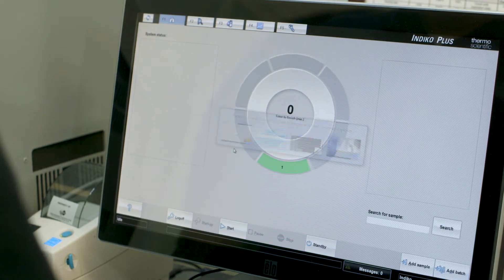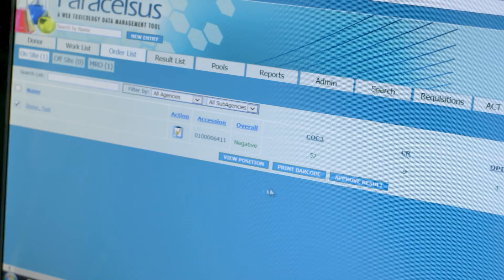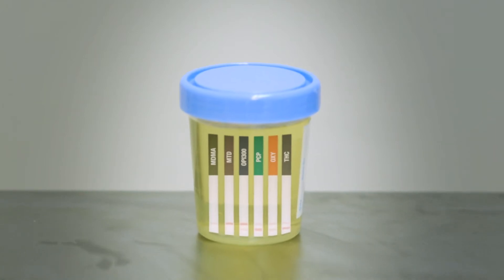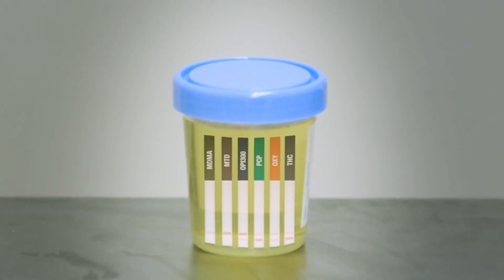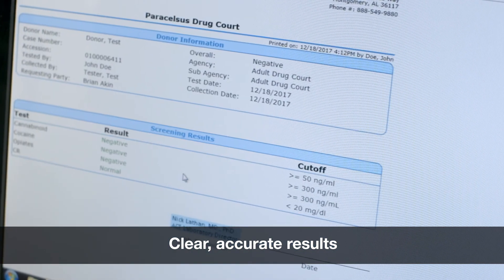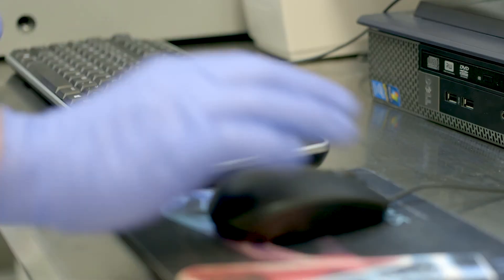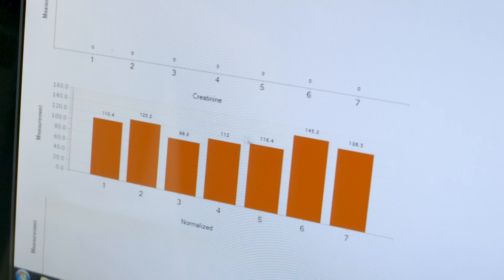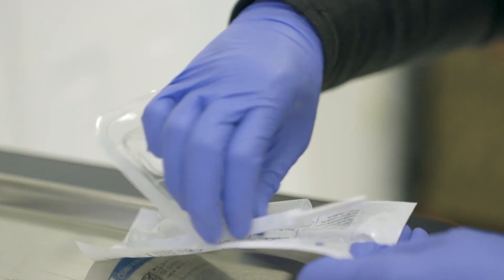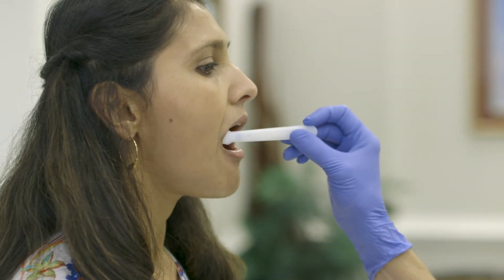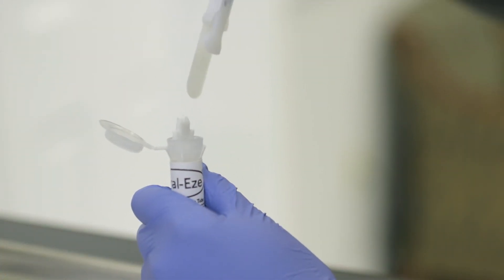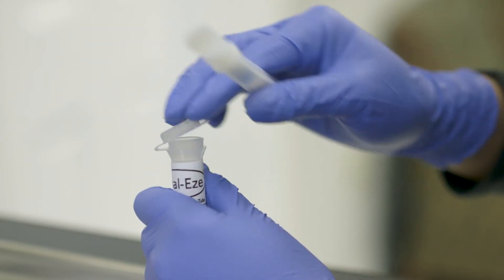Once the run is complete, the lab tech will verify and approve the results sent over from the Indico Plus Analyzer. While point-of-care test results can be ambiguous, requiring repeat testing, the clear, accurate results from automated drug testing usually have greater than 95% confirmation rates. Normalizing results helps assure data is being accurately interpreted. In cases where judges do not want to wait 30 days for marijuana to be flushed out of a participant's system, oral fluid testing technology can be used to detect new use within 24 hours.